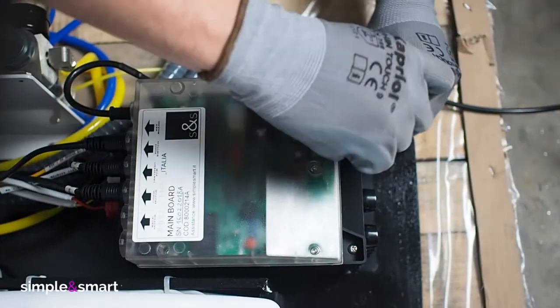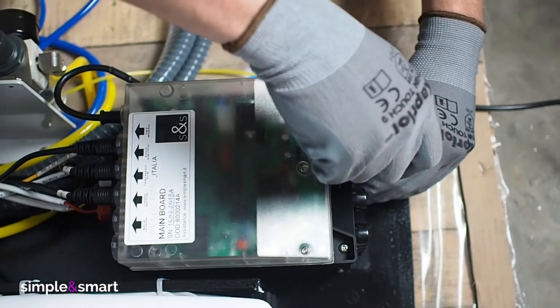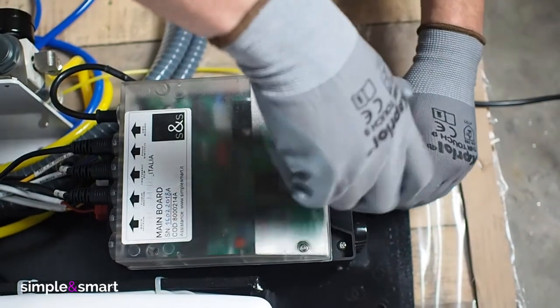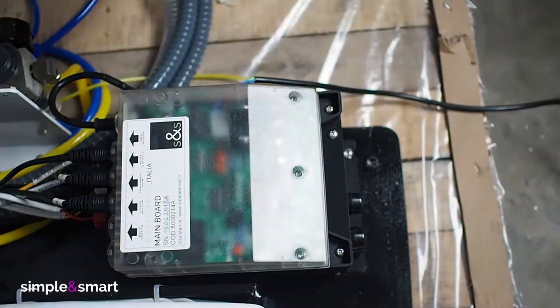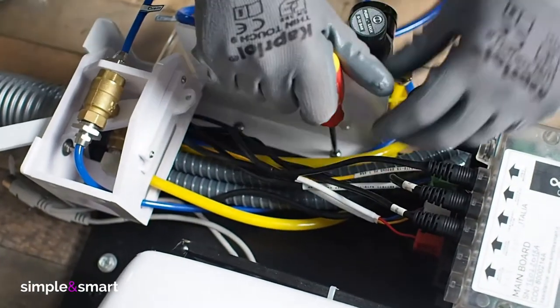Unscrew the two black box screws and the two of the white metal structure to remove it from its place.